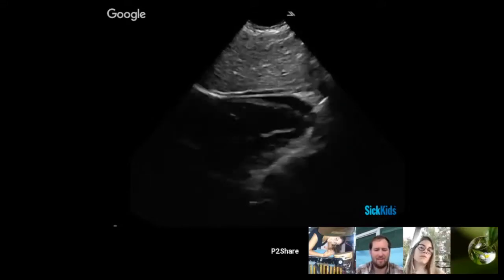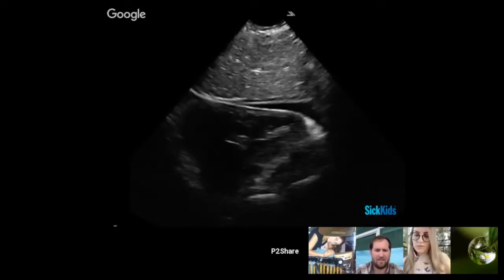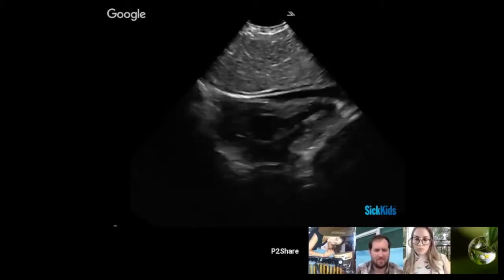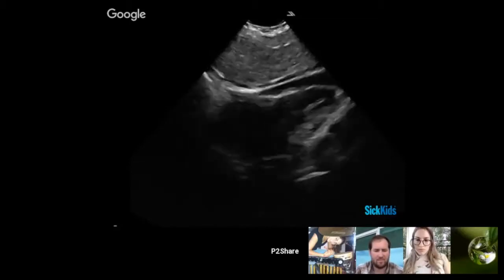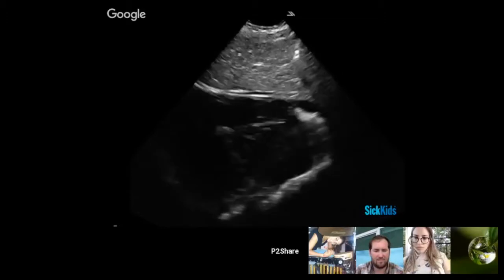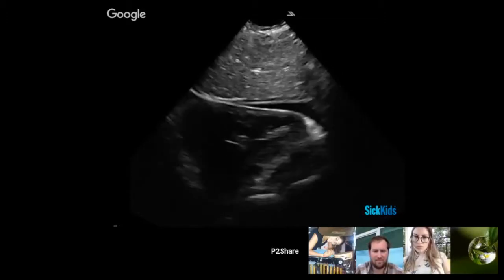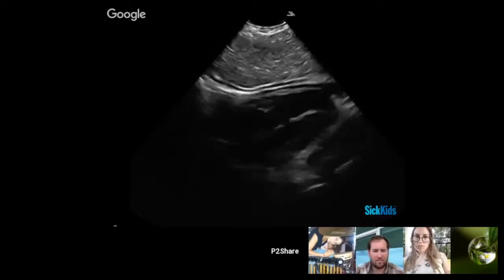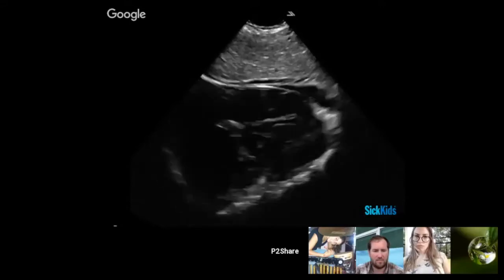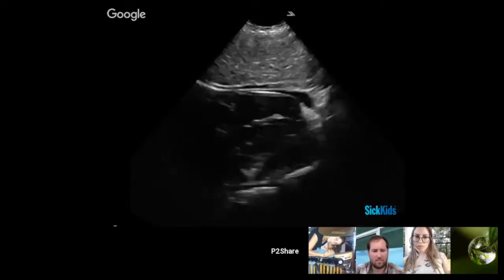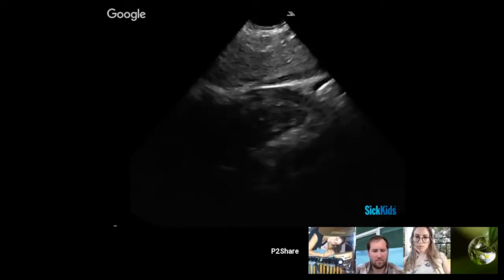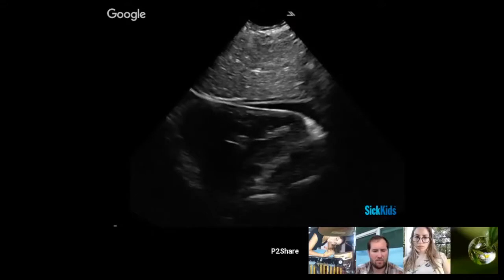Sometimes you have to explain some of these things. The more you ultrasound, the more you'll start seeing kids on your scanning shifts who have viral illnesses — maybe a pericarditis kind of kid — and you'll see this kind of amount of fluid. Knowing that it exists is important because not every pericardial effusion is going to be hemodynamically significant or something that needs to be dealt with. Discriminating those two is going to be something that's clinically relevant.